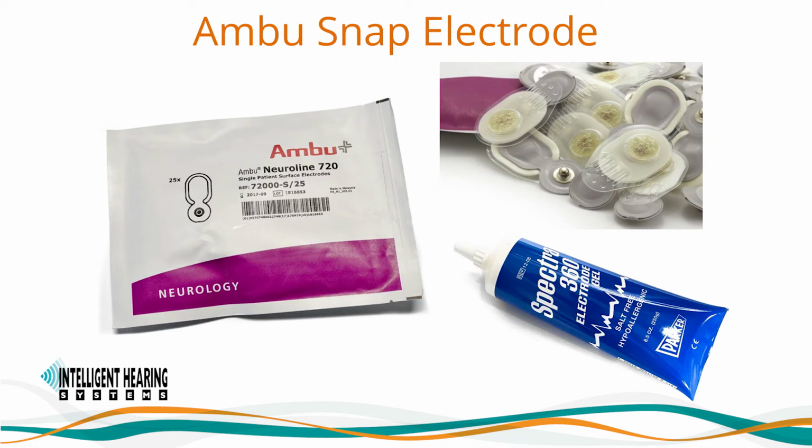Remove any conductive gel on the skin and re-prep the skin with a skin prep pad. Pat the electrode placement area thoroughly dry and reapply a new electrode. Electrodes that are not conductive may require a dab of SpectraGel on the sponge area. Do not use electrodes that are expired, dried, or have been exposed to the elements.